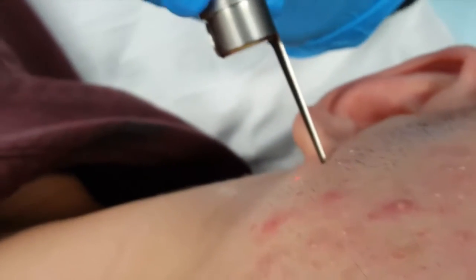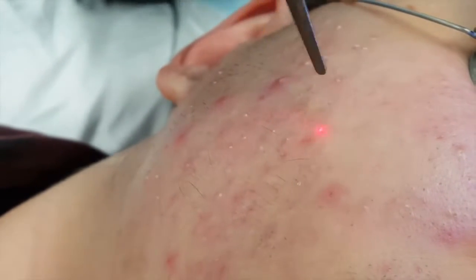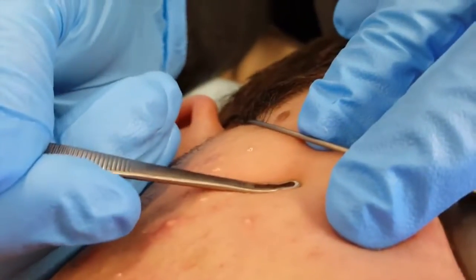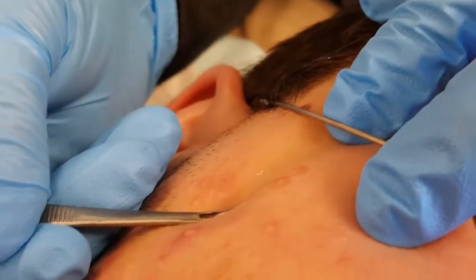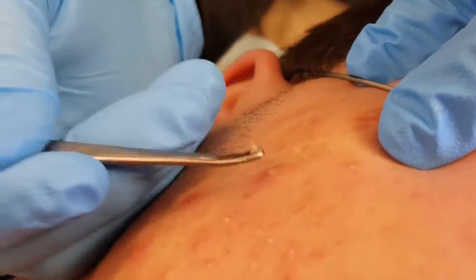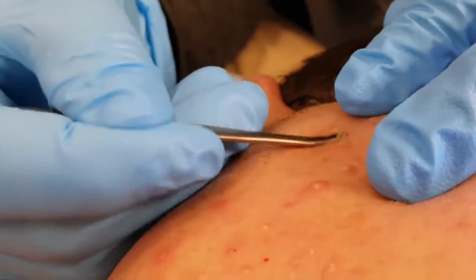This local anesthetic cream has been applied 1 hour prior, so the procedure itself is totally painless. And you can see how quick this is. It's super, super quick. And it's kind of neat as well because if you use a CO2 laser, it coagulates, which means it's bloodless. If we use an erbium laser, it does not coagulate. So in other words, it does not seal off the blood vessels. You get some bleeding. So you can see this is an effective method as well, using a CO2 laser to pre-drill the holes.